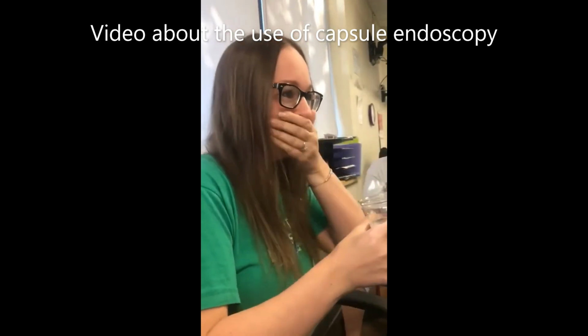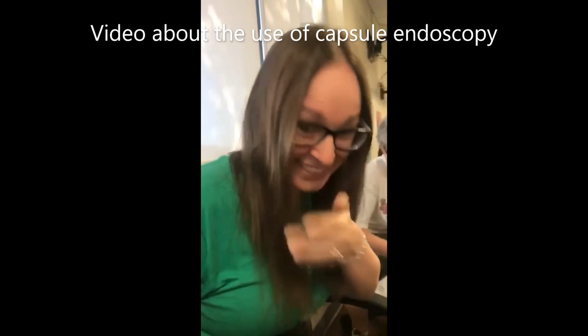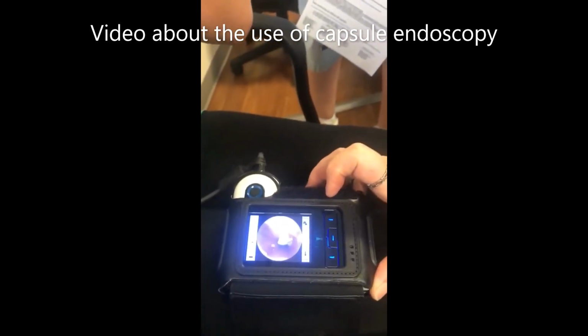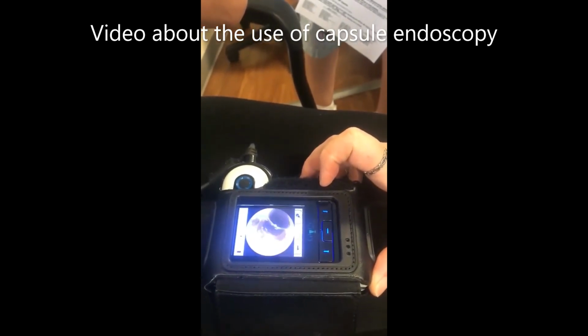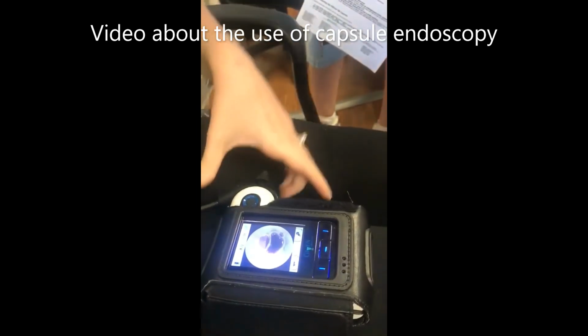Oh my god, I did it. That's your esophagus. We're not to the stomach yet. It's hanging out in your esophagus. Can you see that?